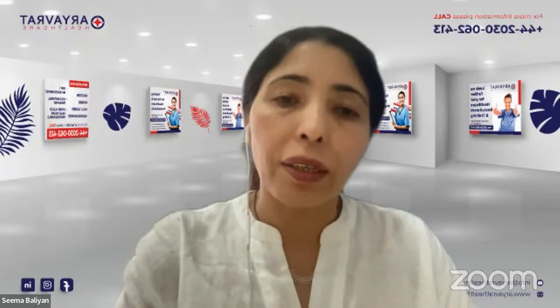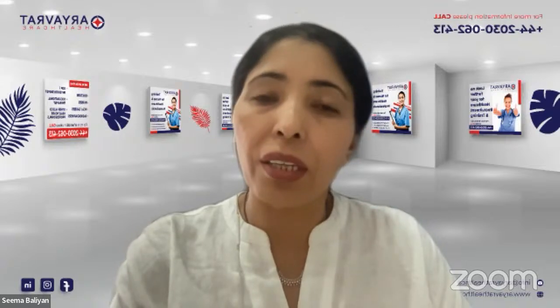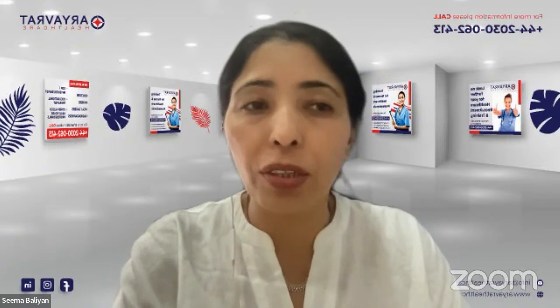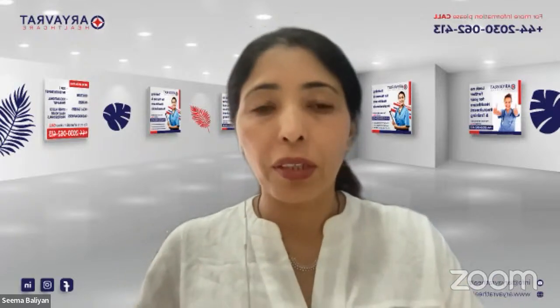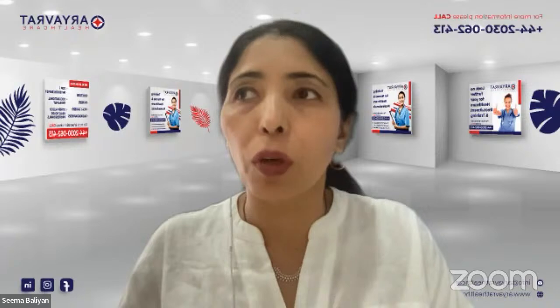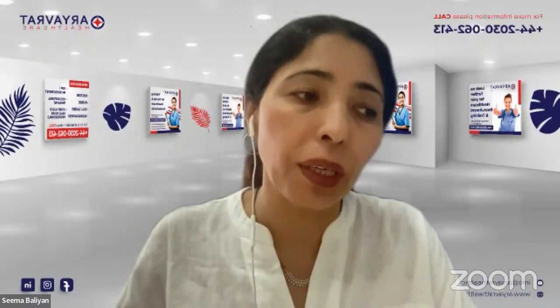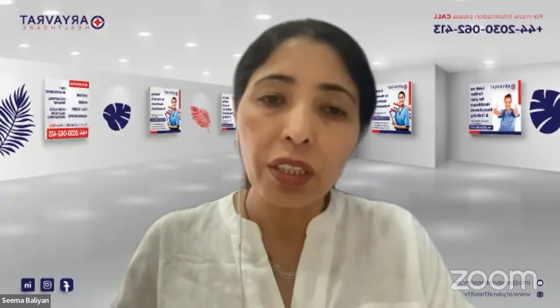Whenever we are educating a patient, there are certain things we need to make sure we tell the patient, and from time to time we need to assess that the patient is understanding, and will be able to use the inhaler or the peak flow in the way that it is meant to be used. So let us start with the peak flow first.